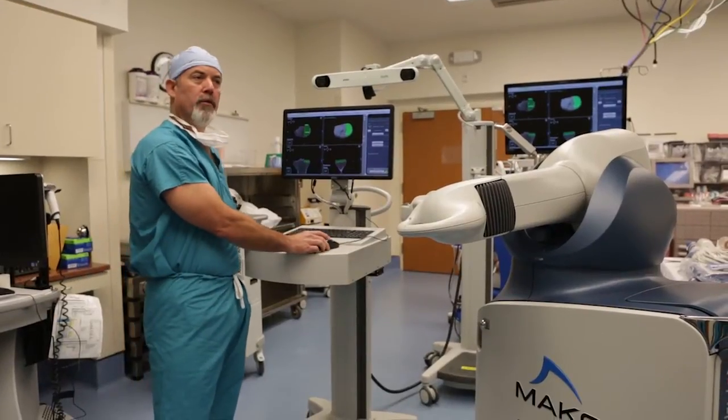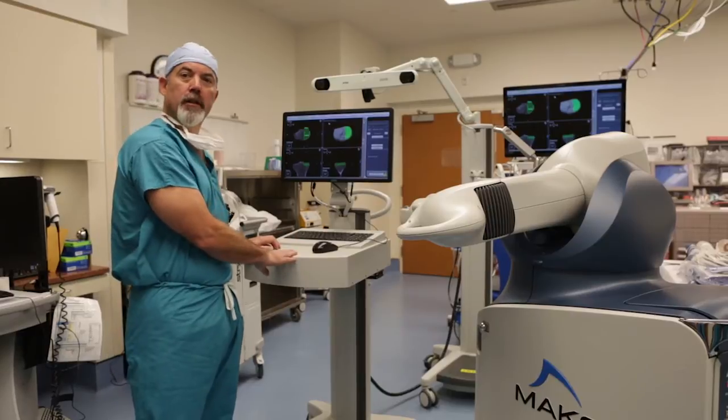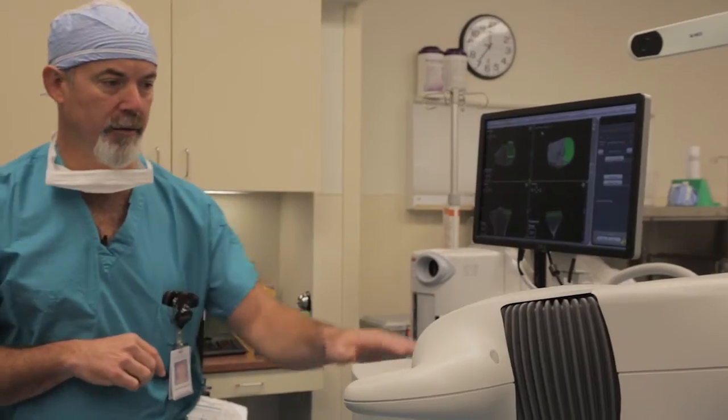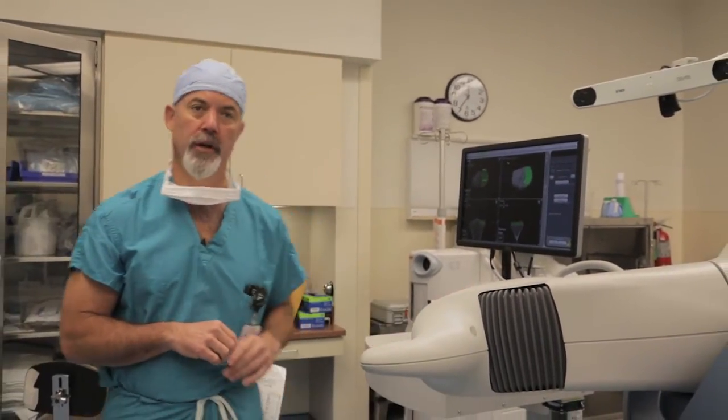I want to walk you through how we plan a Makoplasty case. This is the Makoplasty workstation, where I do the surgical plan before surgery. This device is the Makoplasty robotic arm, which we use to sculpt the bone during surgery.